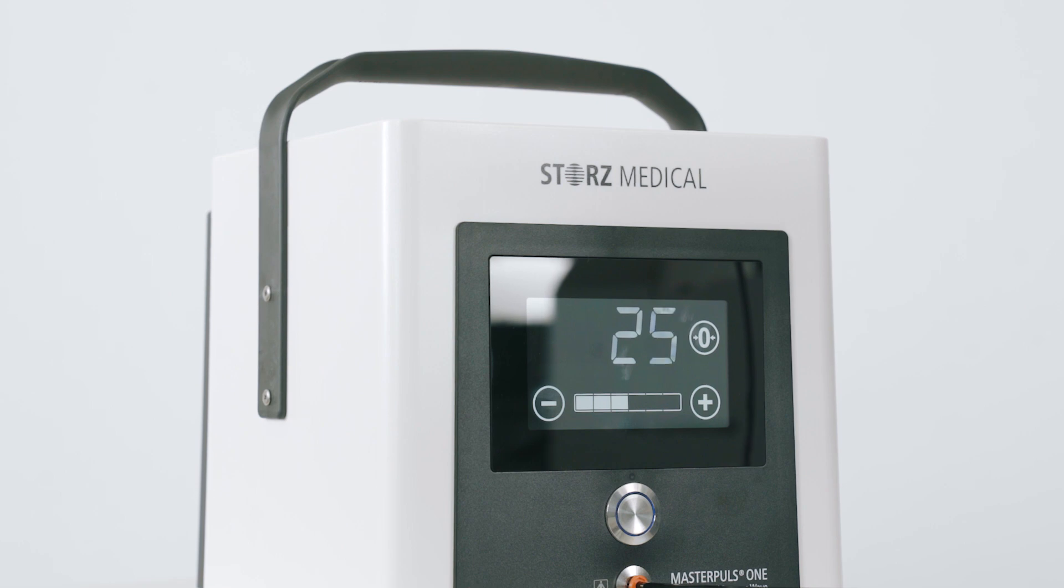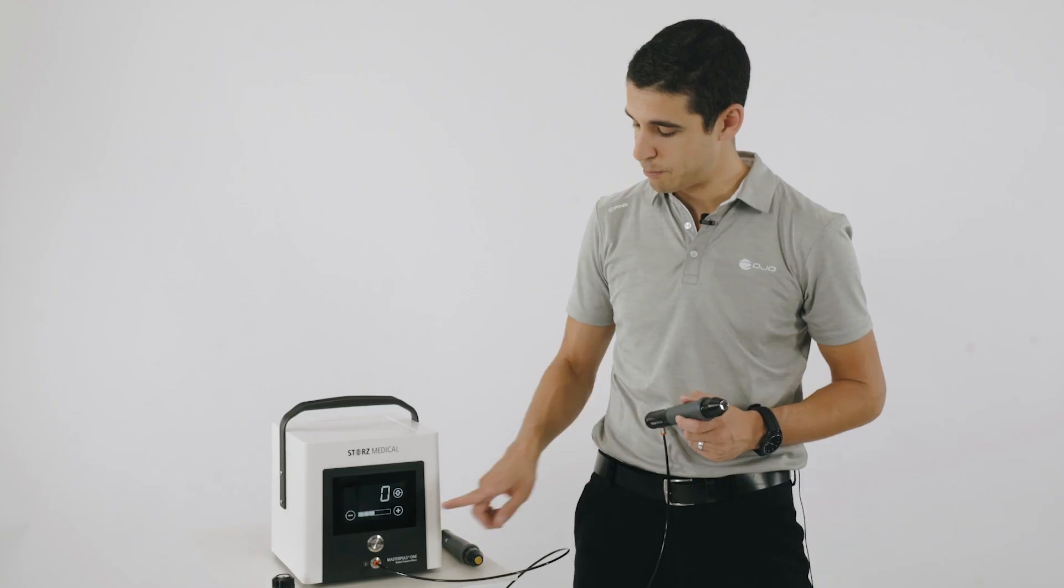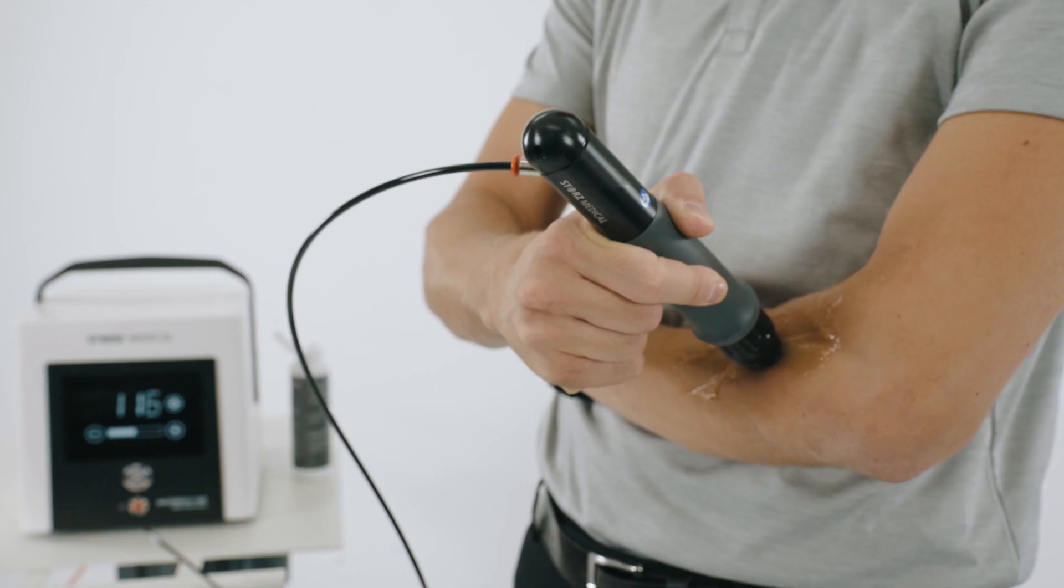To increase or decrease the treatment intensity, simply press the plus or minus button during treatment.